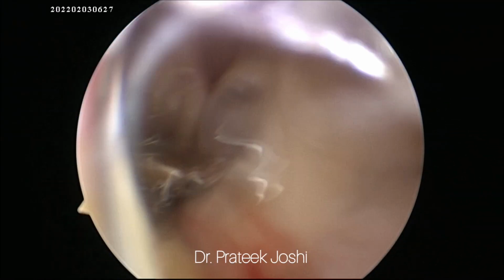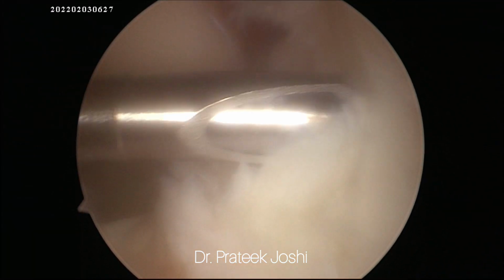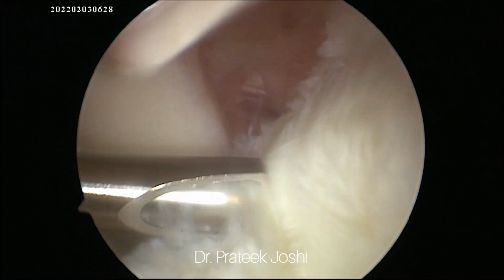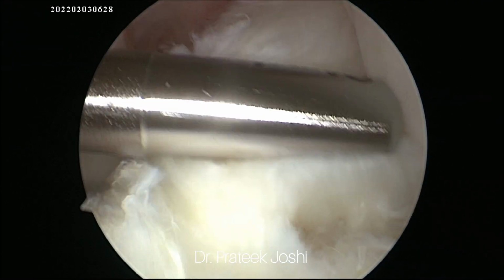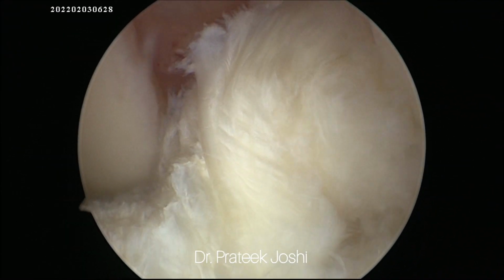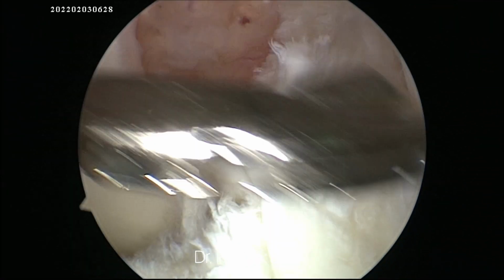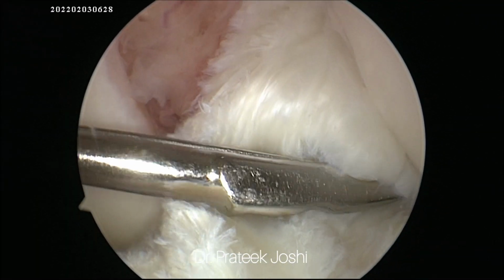So in this case, because of the mucoid degeneration, the ACL size increases, and this leads to impingement, especially on the terminal movements of the knee. So this impingement has to be taken care of with the help of debulking of the ACL, which you can see I am doing with the help of an arthroscopic shaver. So we are going to debulk the ACL so that it doesn't impinge in the intercondylar notch. I am also going to use an arthroscopic punch to do this.